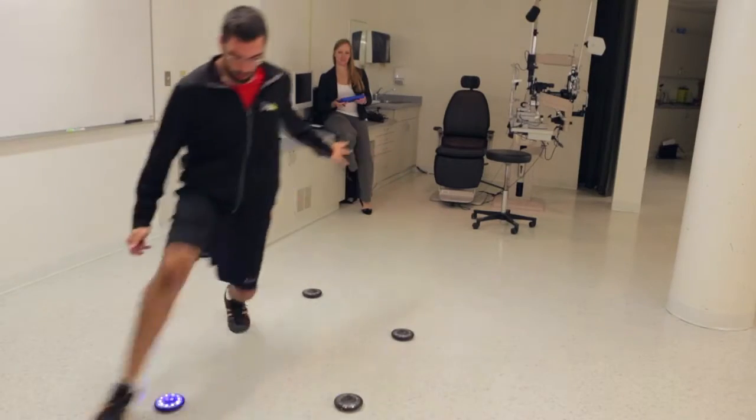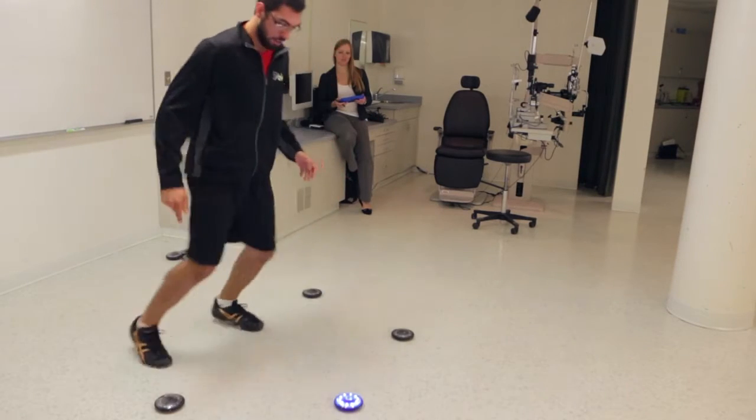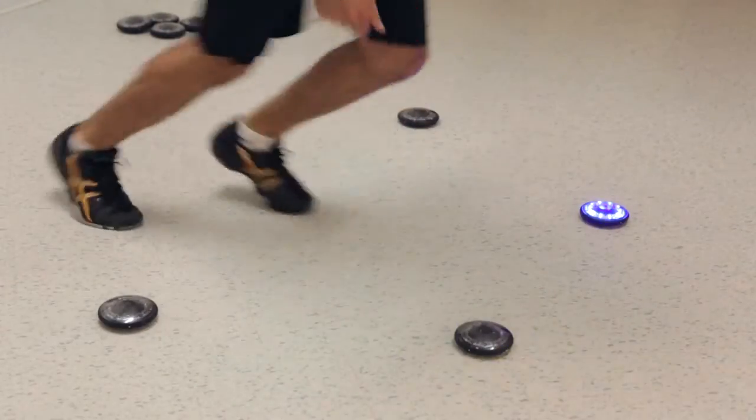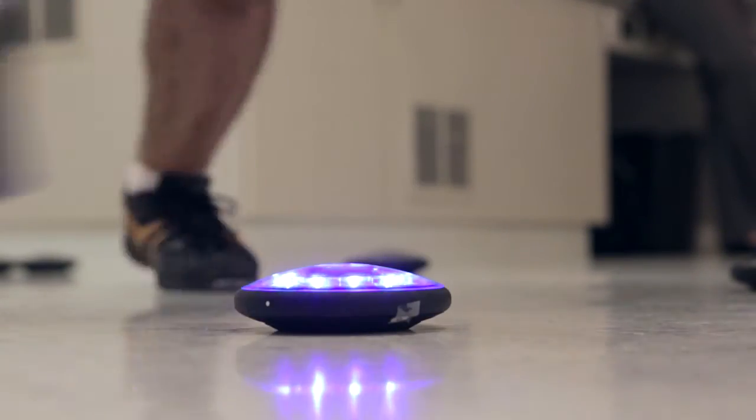Our second piece of equipment is called a fit light trainer, which is also in some ways a reaction time piece of equipment, but it's eight discs that light up. We can arrange those discs on the floor in front of you, on the wall, or on different stands. With those discs, we can create different patterns to train central tasking skills or peripheral tasking skills, aiming skills, and things like that.